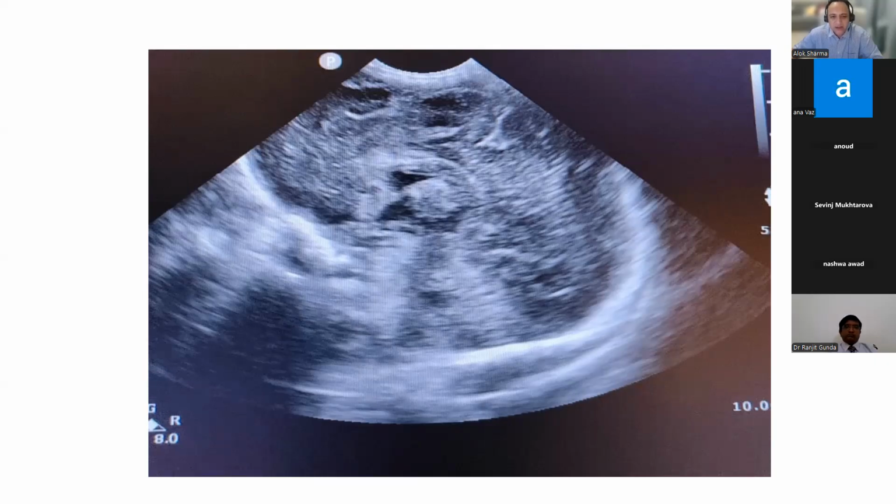So you're absolutely right. A corpus callosum agenesis, a partial agenesis, is a very high likelihood. Very nice image, good depth. My only comment is gain settings a little bit on the higher side. You probably just want to drop your gain settings a bit, but good depth, good penetration, and I mean you've got the whole brain.